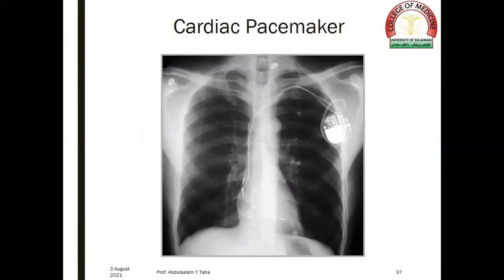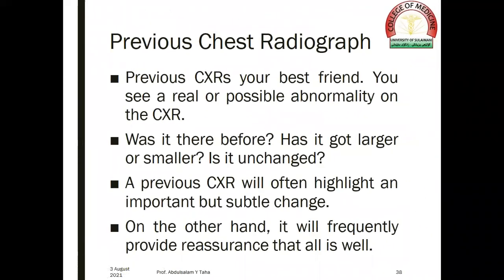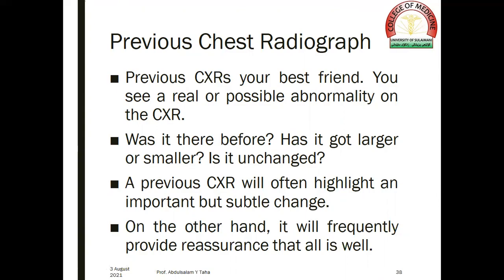Sometimes the plain x-ray may show devices like a cardiac pacemaker, as in this patient. The value of the previous chest radiograph: previous chest x-rays are your best friend. You may see a real or possible abnormality and ask — was this abnormality there before? Has it got larger or smaller? Is it unchanged? A previous chest x-ray will often highlight an important but subtle change, and will frequently provide reassurance when there is no change in the size of the abnormality.